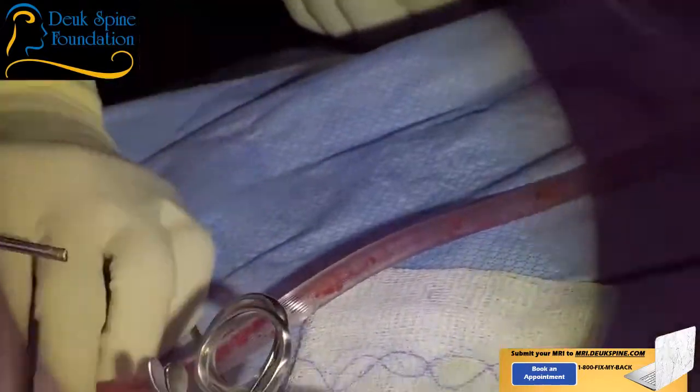Now, some of these are self-tapping screws, you know? So they're self-drilling, self-tapping? Yes. That's why I never use a tap. Just have to have strong fingers. Strong fingers. That's all.